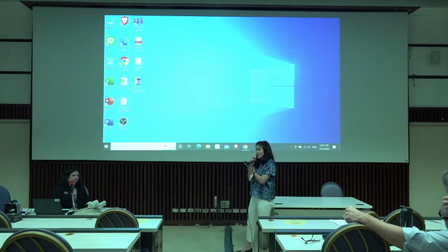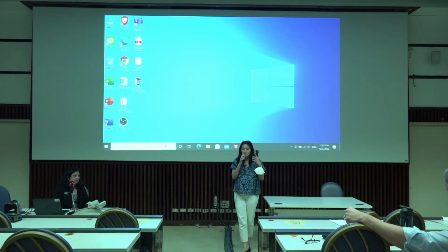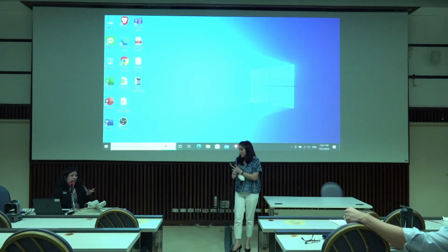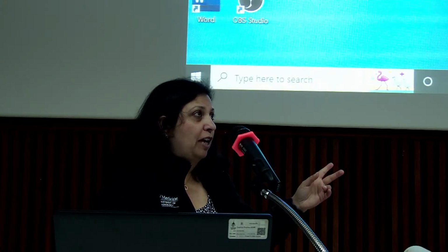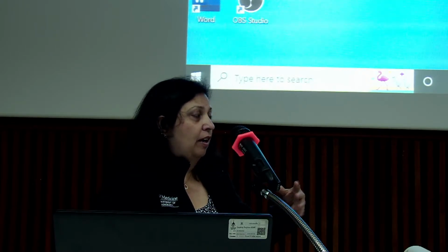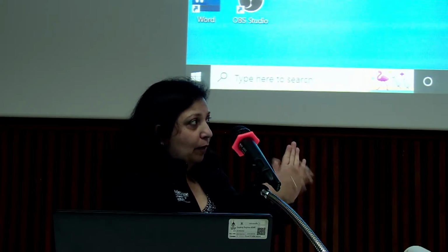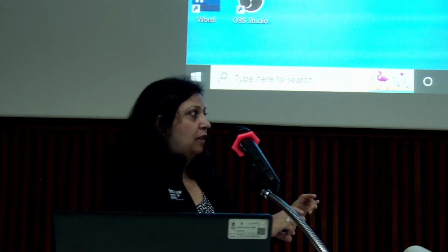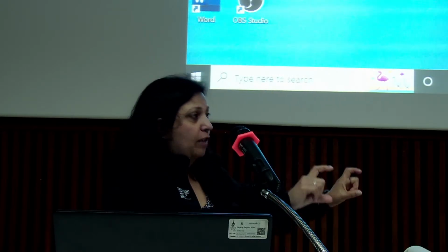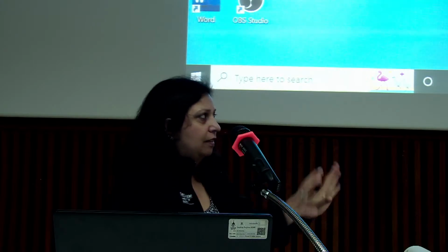I think it's good that you have the letter and send it to the radiologist, and give them options or tell them what to do, because sometimes they see the number and think, okay, what should I do? Similarly, even for fetal dose calculation, my letter has 2 pages behind it with information so that they can make an informed decision about that case. So I will say the risk to the fetus compared to no risk, things like that.